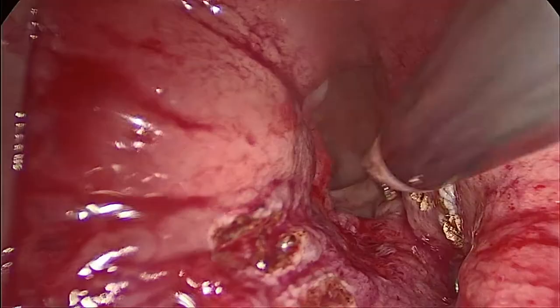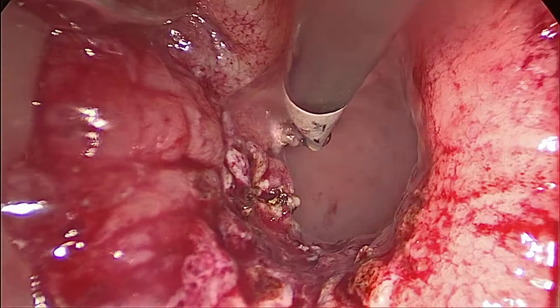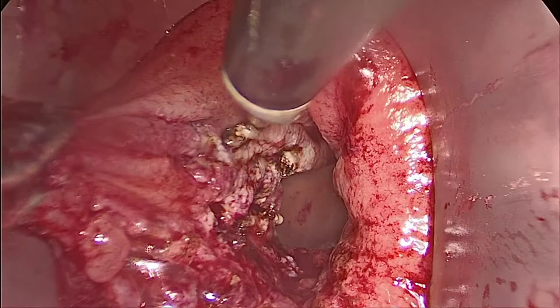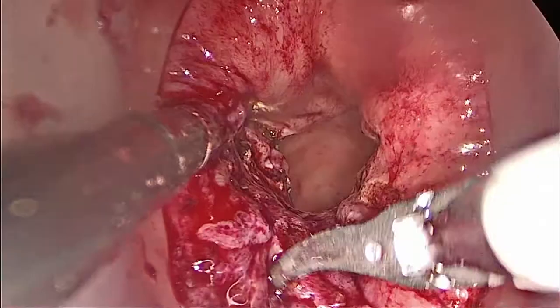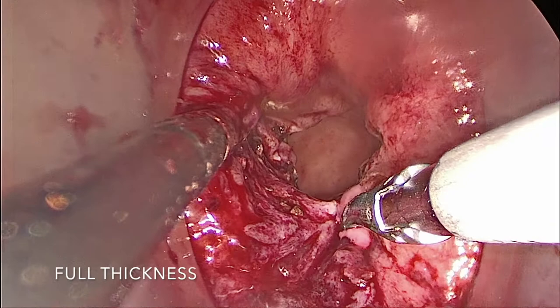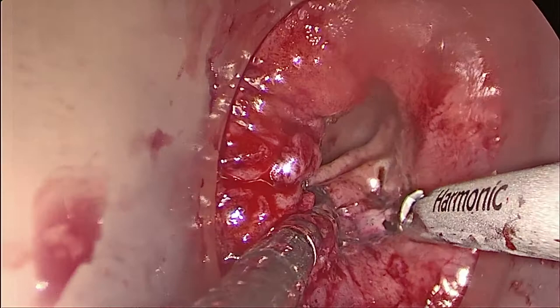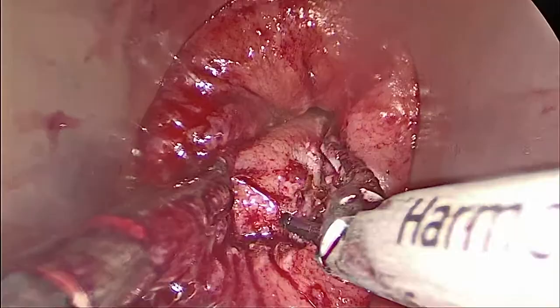The tumor was close to the access channel limit, so in this phase, a slight traction operated by the assistant on the gel cap facilitates marking the lower limit. After marking the limits, we proceed to remove the tumor at full thickness using an ultrasound energy device.